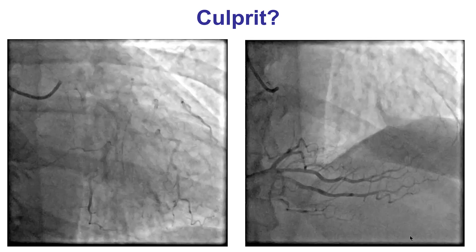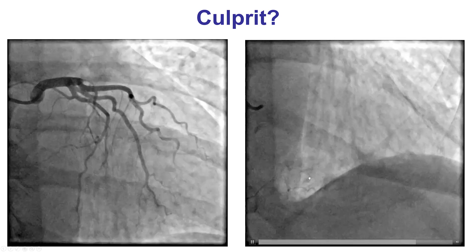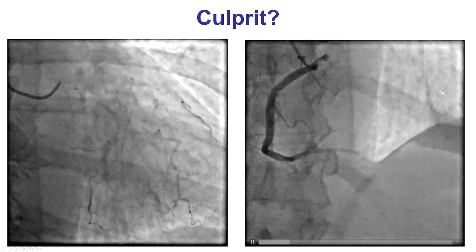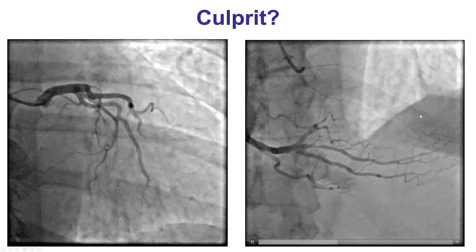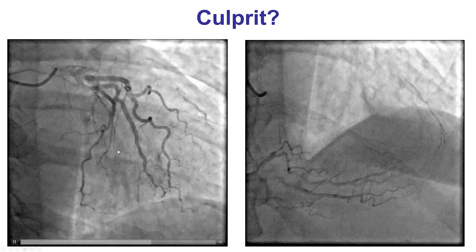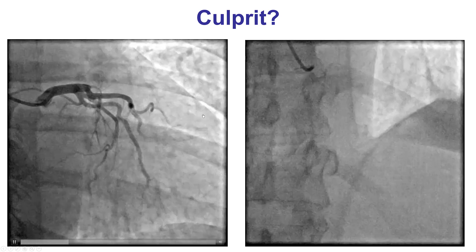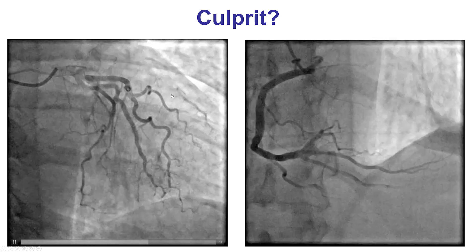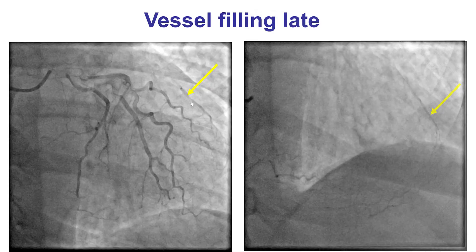Angiography showed a patent right coronary artery without any significant stenosis. However, there was a filling of a vessel on the lateral wall. The LAD was patent, as was the circumflex, but once again there is a vessel on the lateral wall of the heart that is filling late via collaterals.